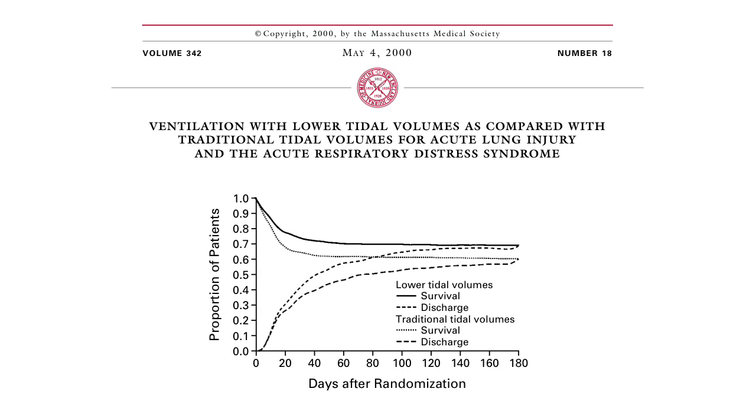At the same time, plateau pressure, the maximum pressure applied to distend the lung from tidal volume, should be closely monitored and maintained under 30 centimeters of water. The gradient between plateau pressure and positive end expiratory pressure, referred to as the driving pressure, should be minimized as much as possible, and the risk of ventilator-induced lung injury when driving pressure is above 15 to 20 centimeters of water is probably high.